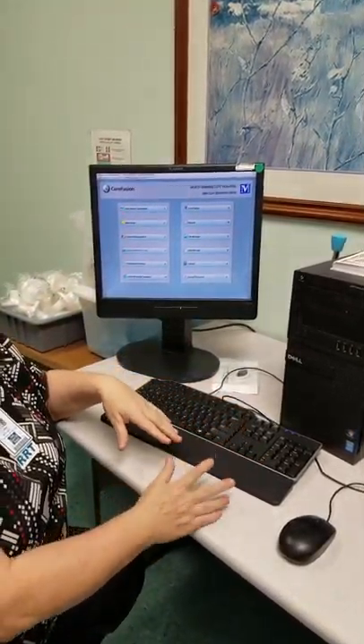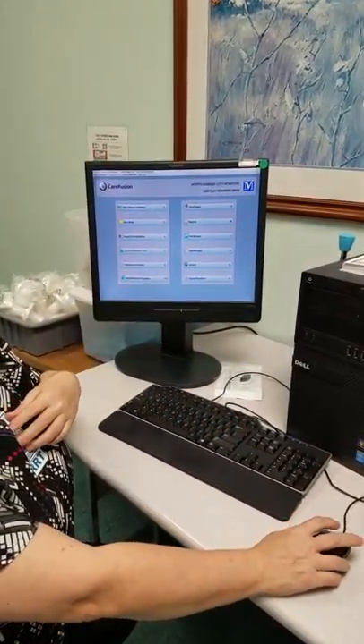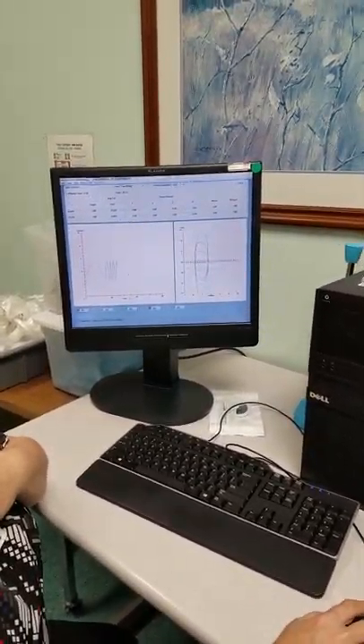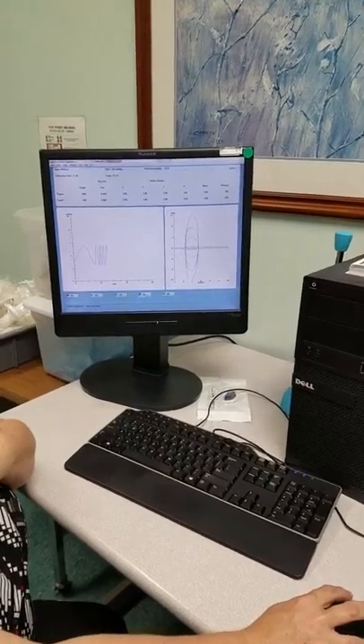Assuming you've already done your flow volume cal, now you're going to move on and calibrate the box. Unfortunately I got to go back here to get there. That's the F4 button — you're going to hit F4.